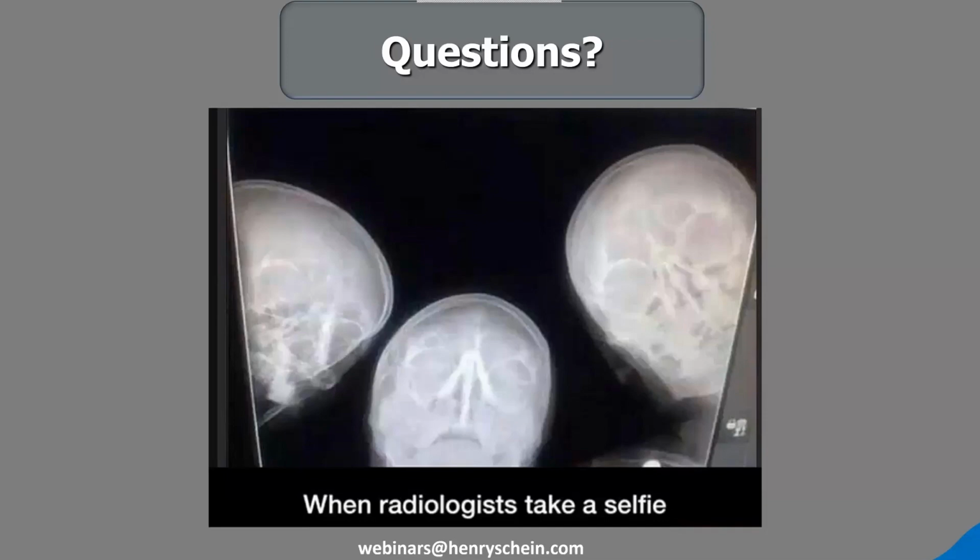We know that, of course, we'll get held to the same standards as our specialists. So I think that the great rule of thumb is make sure you look through all of your scans. The people that get in trouble are gross violators that never looked at all, especially if it's in our area, in the maxilla or the mandible. And again, if you come across something you don't know what it is, at that point, you'd want to go ahead and refer it on.